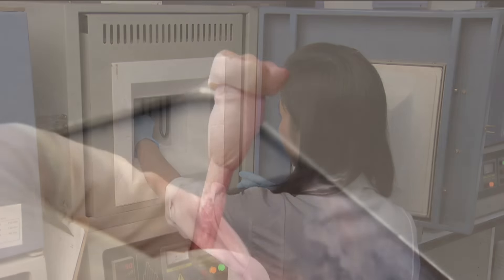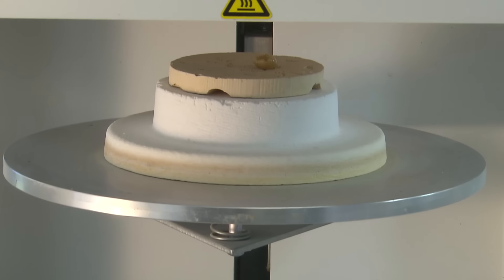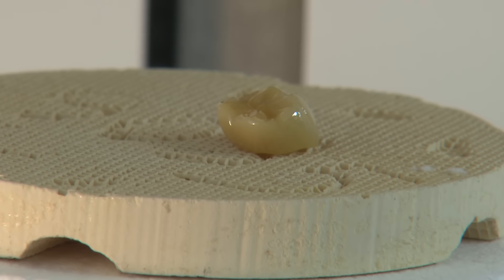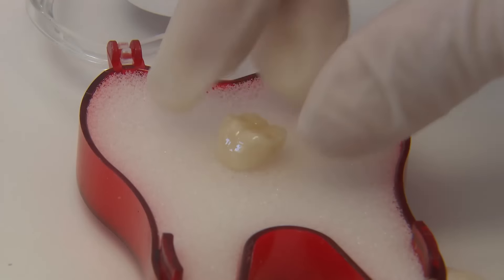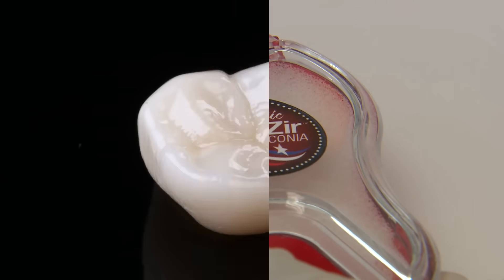Once fully sintered, the crown then receives an additional glaze application and is fired once more to allow the glaze paste to fully fuse to the restoration. After the glaze cycle, the restoration is now completed and, as you can see, we have a beautiful restoration that is then finished and placed into the Bruxer box and is delivered to us within a shortened period of time.